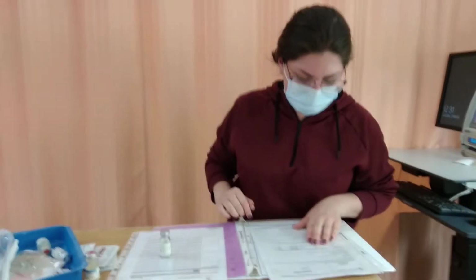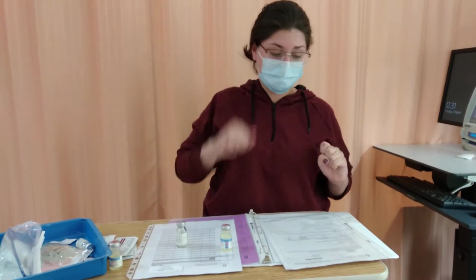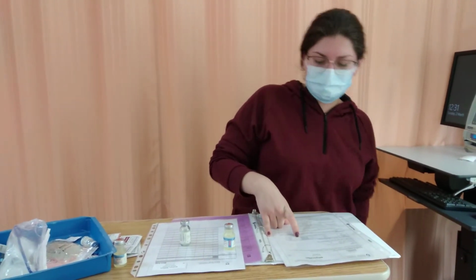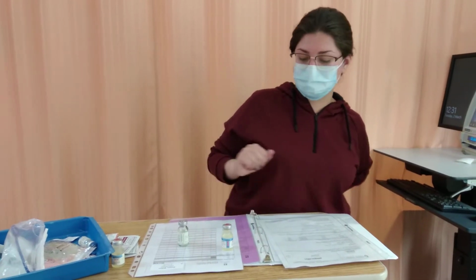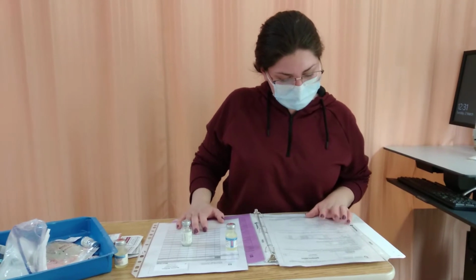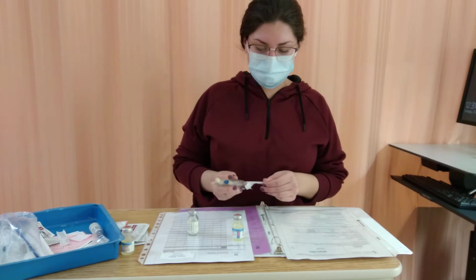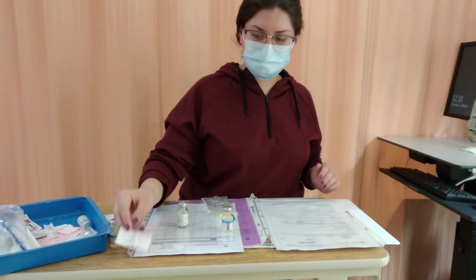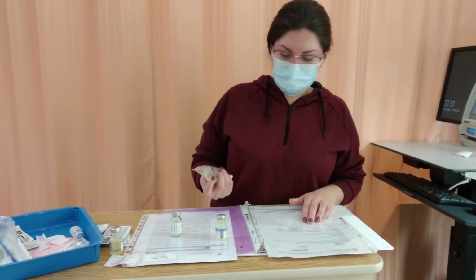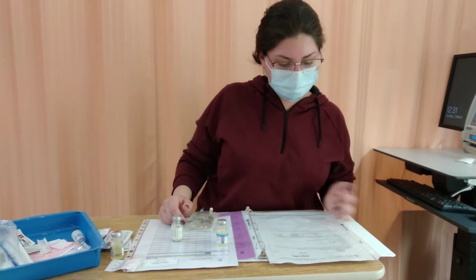Okay, so we're going to need sterile water, 3.4 milliliters to reconstitute it with, and we're going to have a 250 milligrams per milliliter concentration and a final volume of 4 milliliters. Okay, so this is our label that we'll use soon. We're going to choose a 50 milliliter normal saline bag.